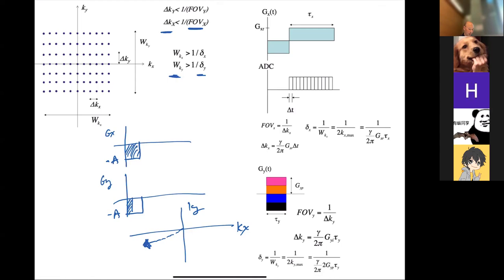Generally in MR, we want to push the equipment, but we never want to push it that hard. It's like if you're traveling with your friend and they're walking slowly, you don't necessarily need to run to get to the restaurant first, unless you want to get there first and just wait for them. The gradients are these high-powered machines, so in general we don't push them unless we need to.